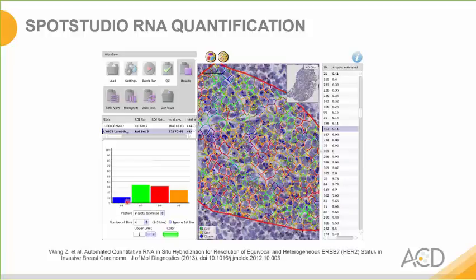So the analysis shows approximately 10% blue cells that have 0 to 1 dot per cell, and so the blue cells are highlighted by the blue boundaries. Similar for green, where approximately 30% of the cells contain between 1 and 3 dots, and so forth.